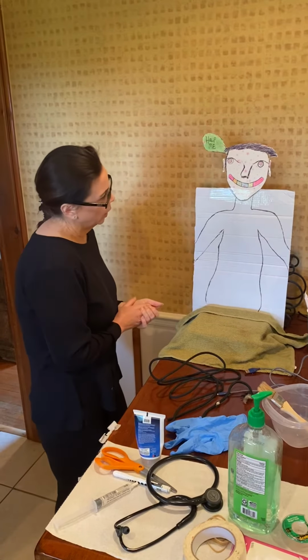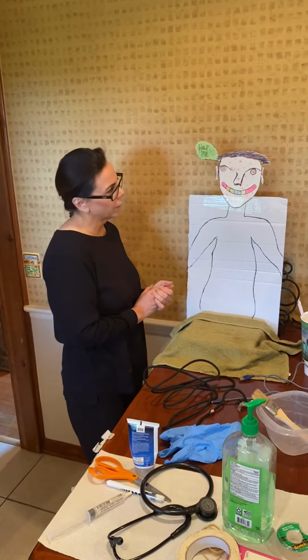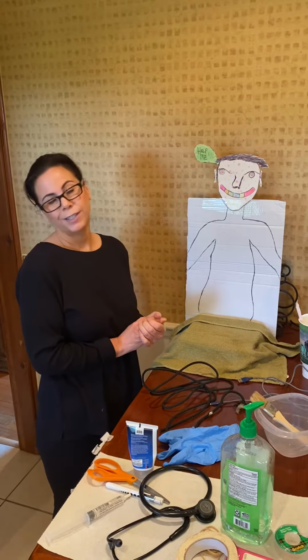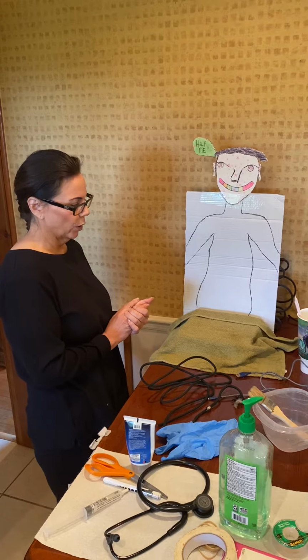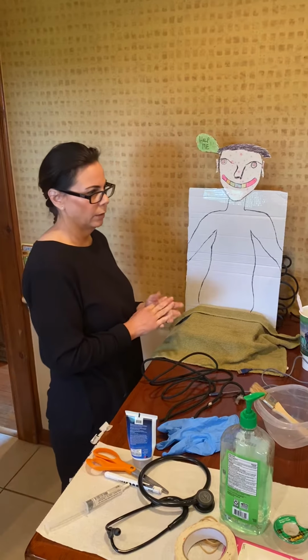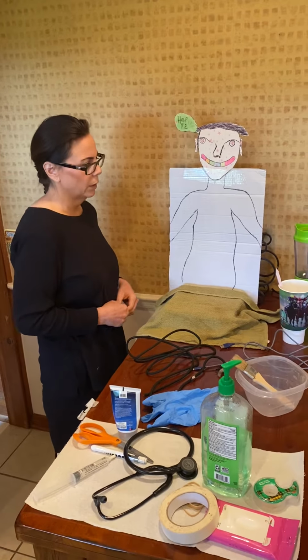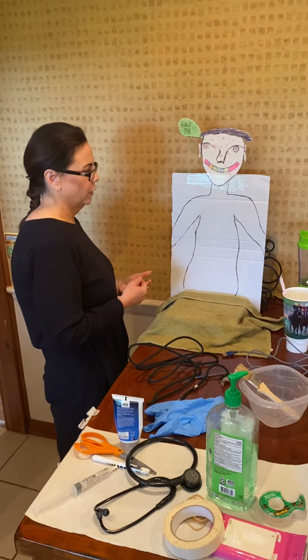Hello, can you tell me your name? I'm John Smith. Great, John Smith. Can you tell me your date of birth? 9970. Okay, great. What we're going to be doing today is inserting an NG tube.